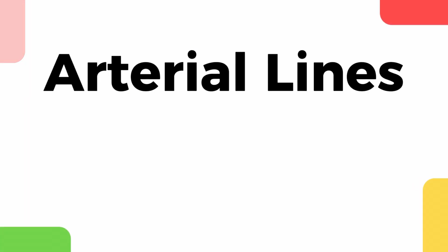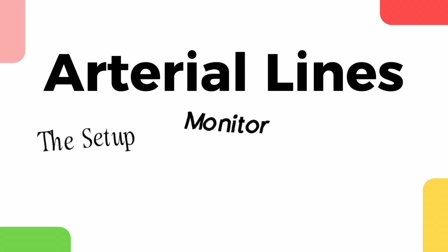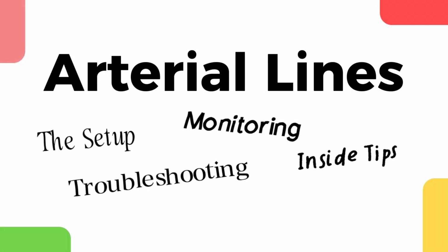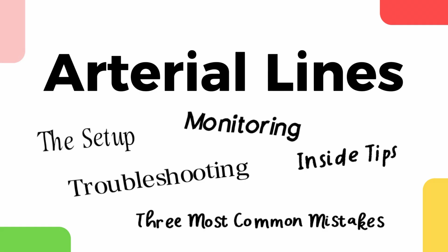So, in this video, I am going to give you everything you need to know about arterial lines. We'll cover the setup, monitoring, troubleshooting, and I'll share some insider tips that took me years to learn. Plus, I'll show you the 3 most common mistakes that can literally kill your patient and how to avoid them.